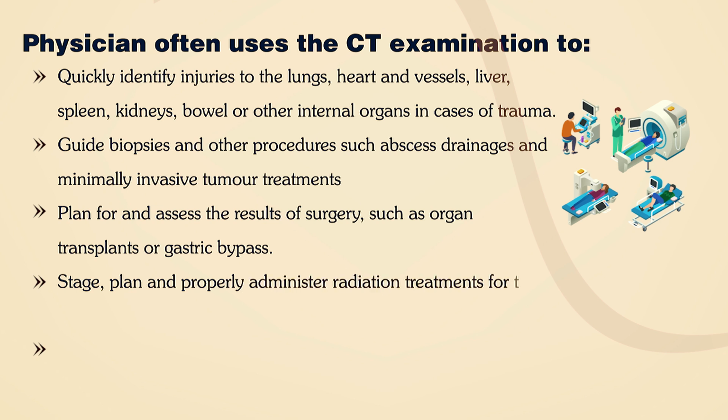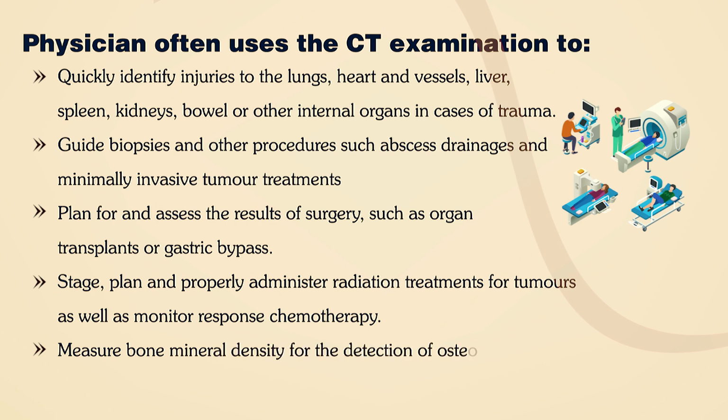Guide biopsies and other procedures such as abscess drainage and minimally invasive tumor treatments. Plan for and assess the results of surgery such as organ transplants or gastric bypass. Stage, plan and properly administer radiation treatments for tumors, as well as monitor response to chemotherapy. Measure bone mineral density for the detection of osteoporosis.